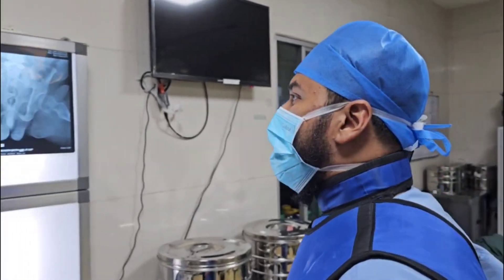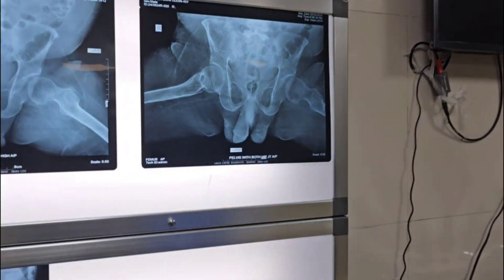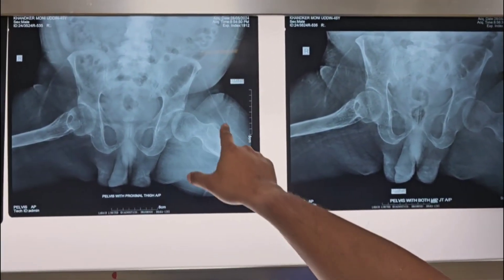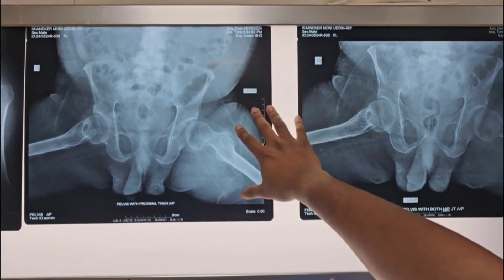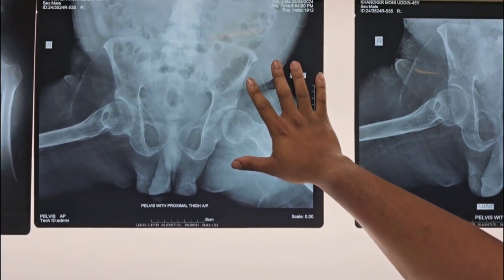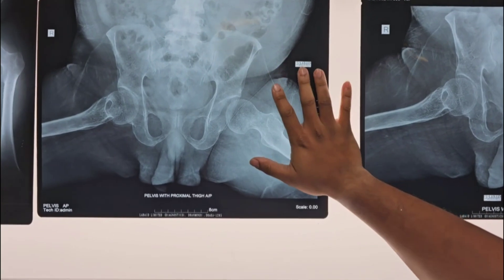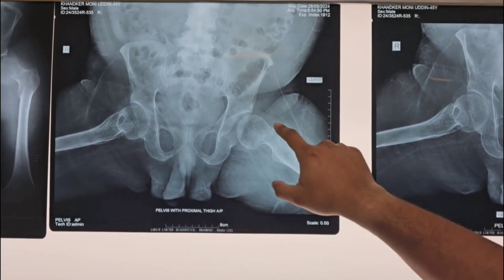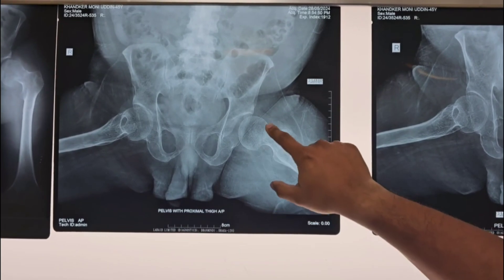Welcome to today's operation theatre. Today our case is a traumatic case — fracture of neck femur of the left side. Just observe this. It is not an x-ray of a typical person; it is an x-ray of a polio affected person. Here is the fracture line at the left hip.